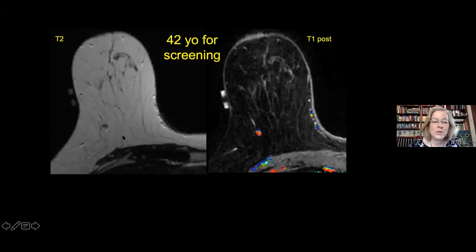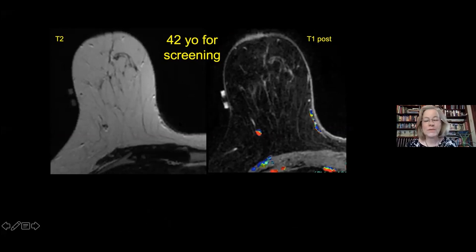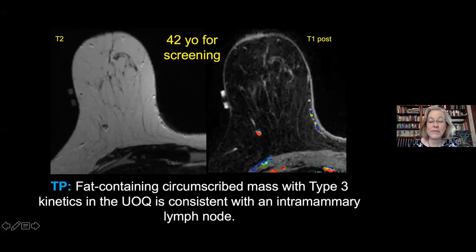Another 42-year-old patient: on T2 there's a small mass with a darker rim and higher signal center, showing a mixed kinetic pattern on the kinetic map. You could correlate this with her mammogram—this is just an intramammary lymph node. Intramammary lymph nodes often have type three or washout kinetics, so you don't need to biopsy every lesion with suspicious kinetics. You really need to correlate with other features you're seeing on the sequences.